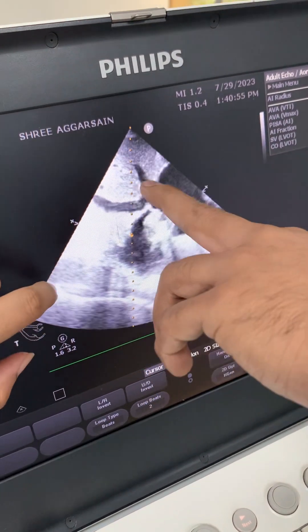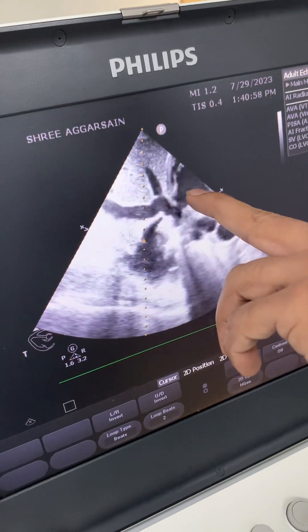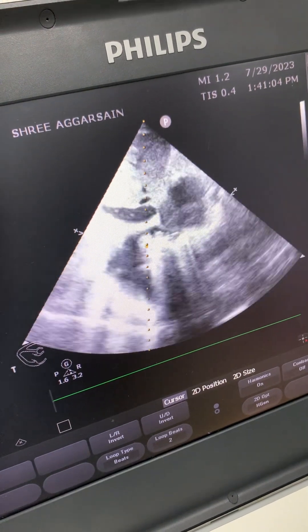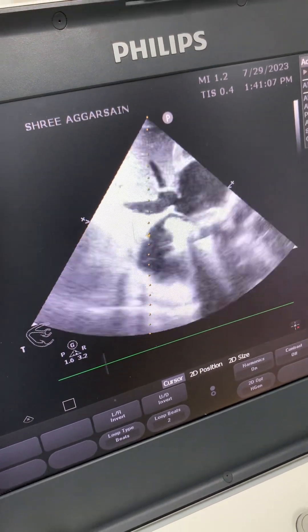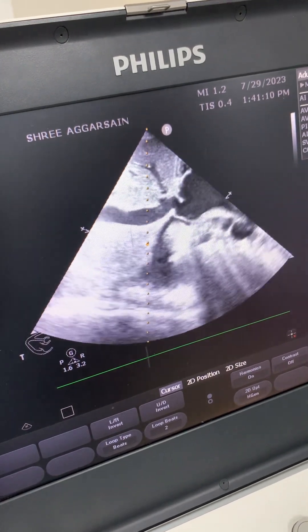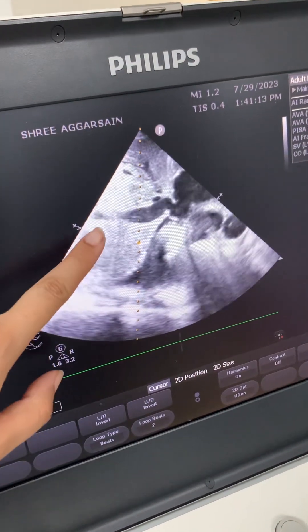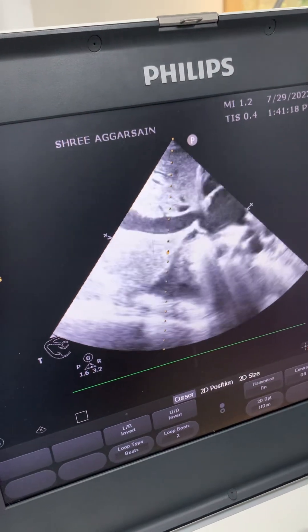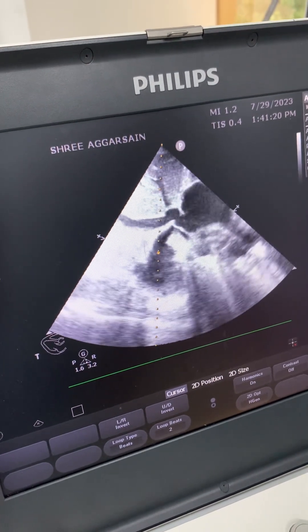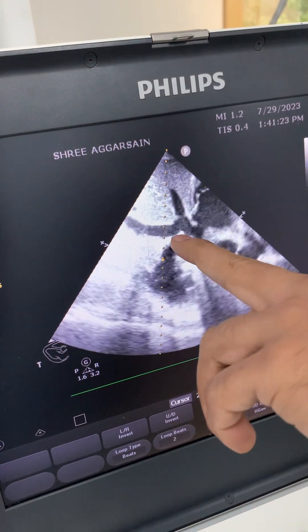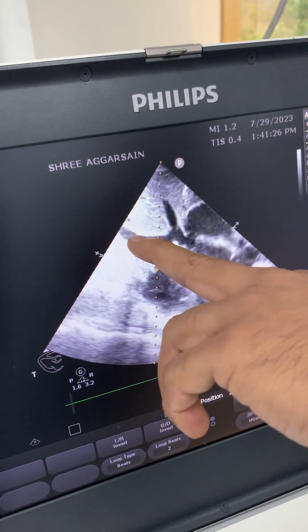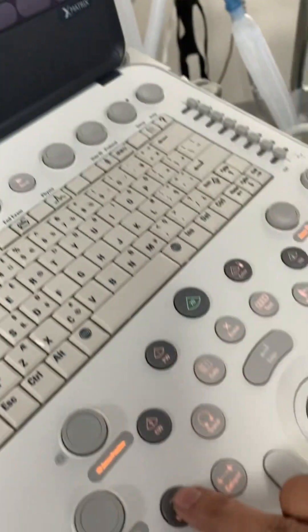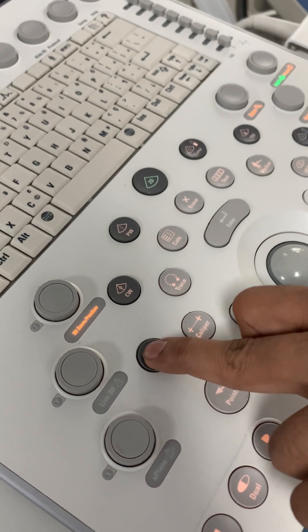The perfect picture shows the inferior vena cava (IVC), the opening of the hepatic vein, and the right atrium — all in one image. We need to adjust clockwise or anticlockwise until the hepatic vein opening is visible. Once we have that, we go 1.5 centimeters away from the hepatic vein opening and then press M-mode.